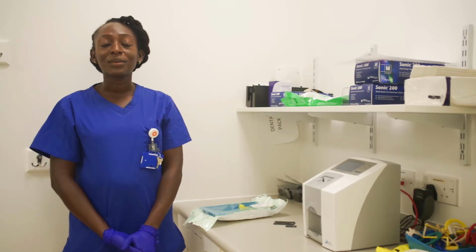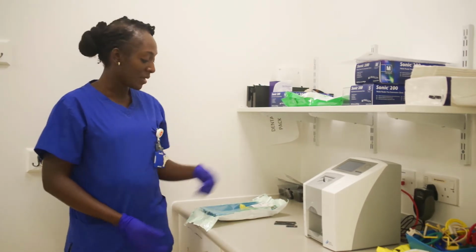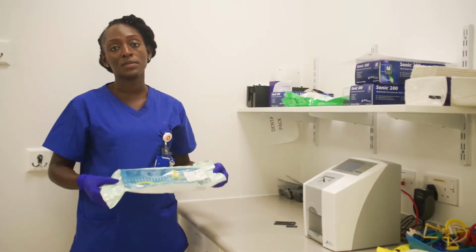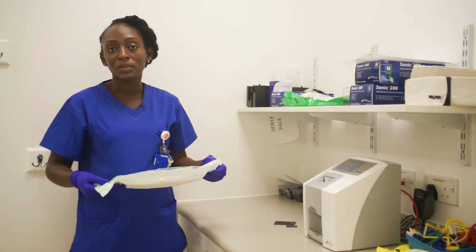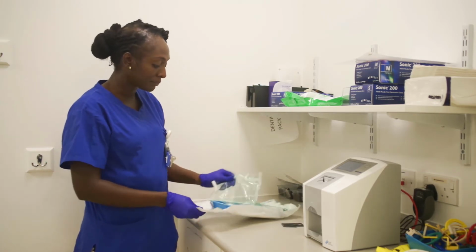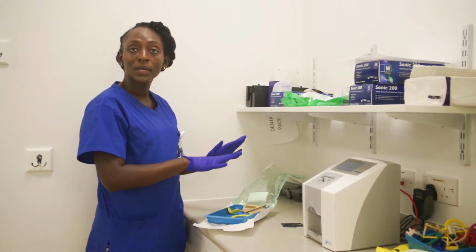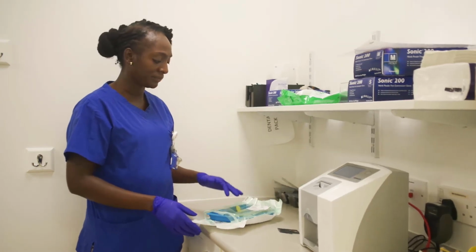So I'm going to take you through how to assemble intraoral holders. What I've got here is a posterior holder, and oftentimes the holders come pre-packed to keep them sterile. So before assembly, you have to open the packet, and that's your clean pad. You assemble them and leave them there, and cover them before you bring the patient.